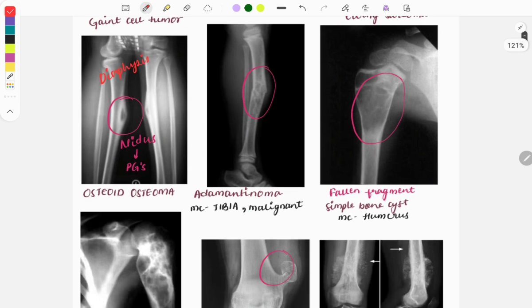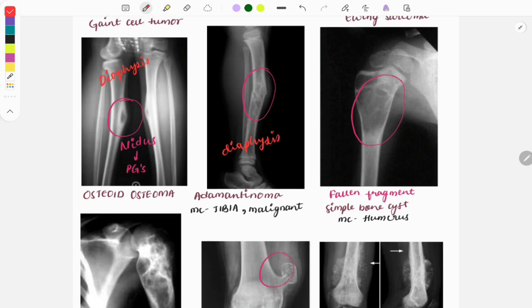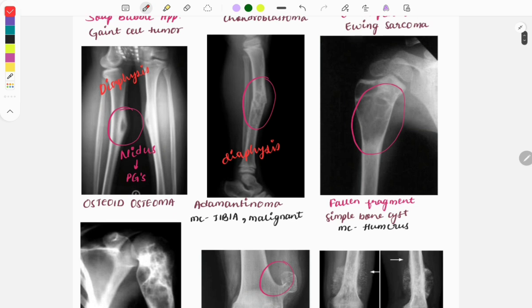Adamantinoma is also a diaphyseal lesion; the most common site is the tibia and it is a malignant tumor. The next image shows a simple bone cyst — you can see a fallen fragment sign, like a leaf fallen from a tree. The most common location is the humerus.